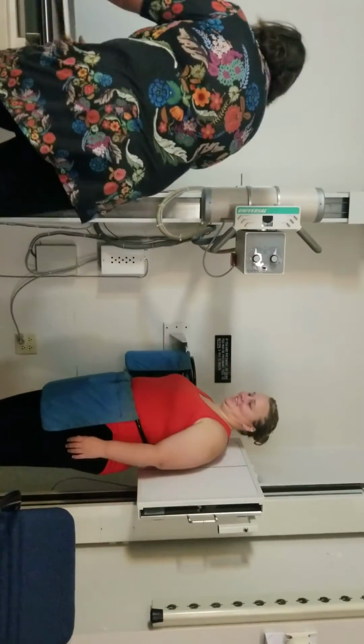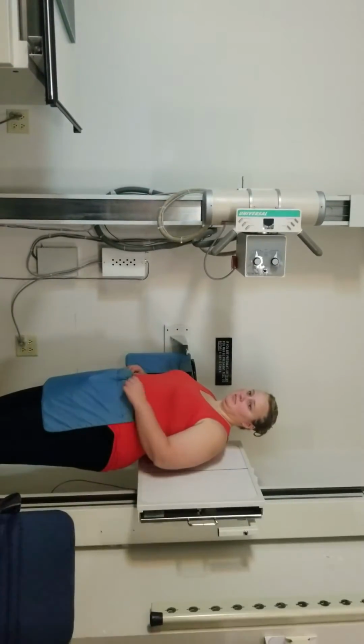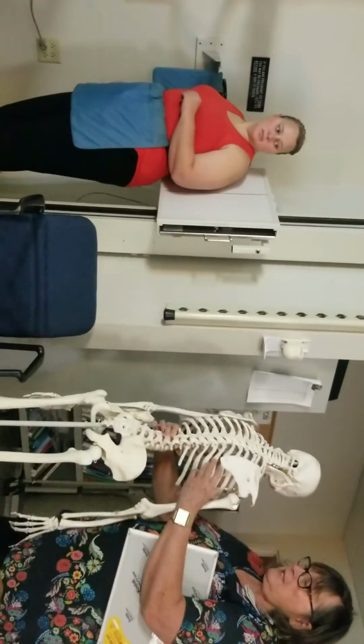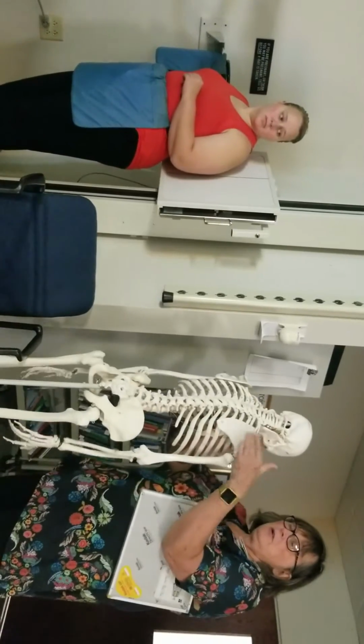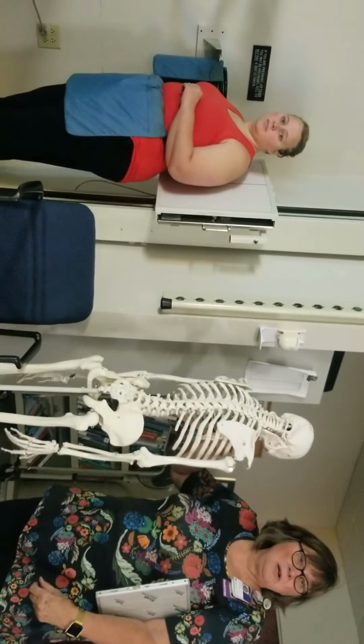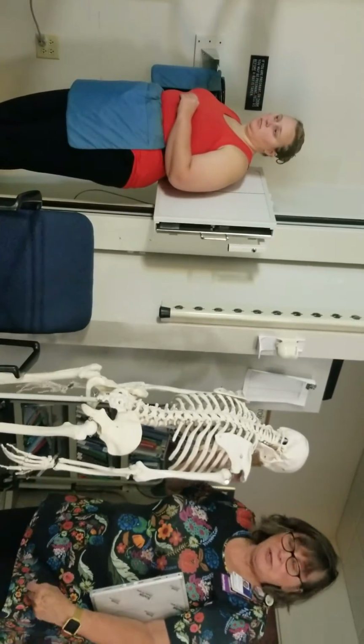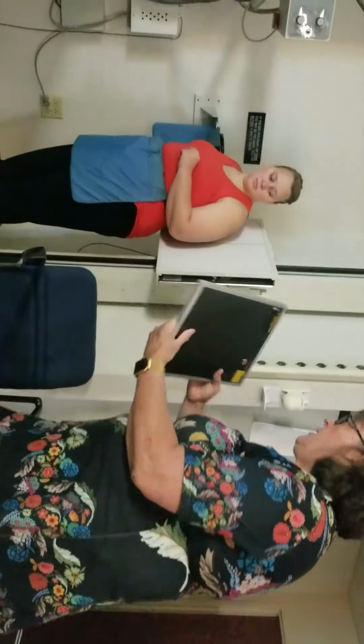So, if we look at the scapula, is it longer or wider? Longer. So how do you think we're going to put our film in? Portrait. Okay. So 10 by 12 portrait.